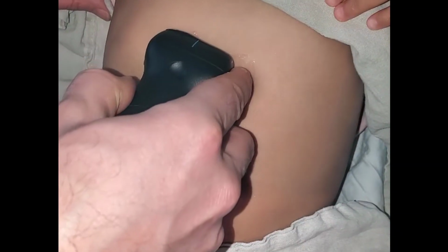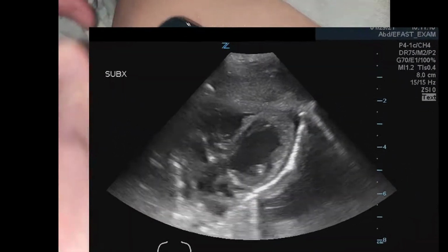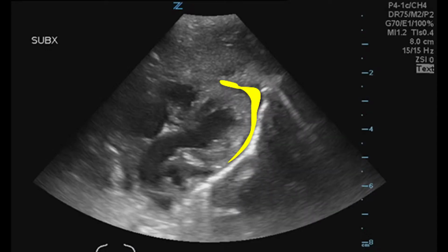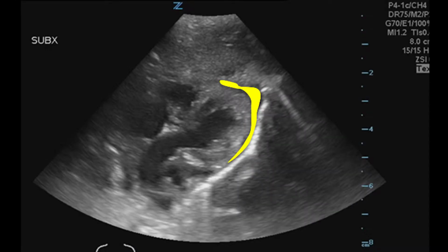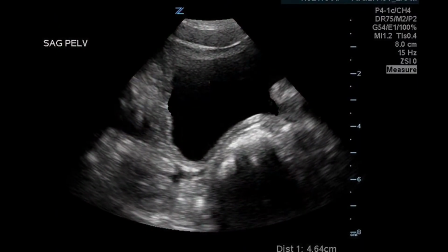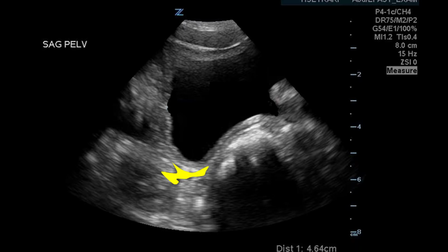In the subxiphoid and peristernal views, you see a thin dark stripe around the heart, which mostly disappears during diastole. Is this an effusion or blood? Just beside the bladder is a small but clearly visible pocket of free fluid. It's not much, but could it be pathologic?